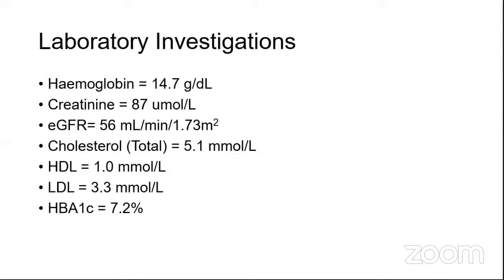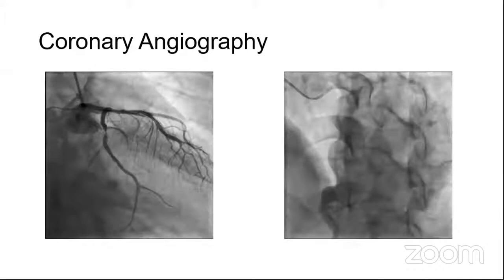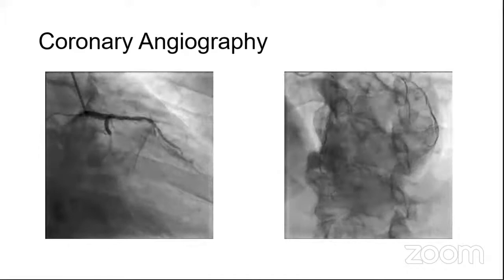So we brought him into the lab yesterday for a diagnostic angiogram, and that showed that he had two-vessel disease involving both the ostia of the LAD and circ, as well as a distal left main stenosis. So I think you can see the angiograms at the moment.